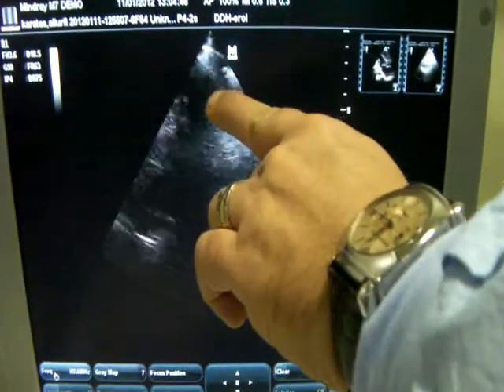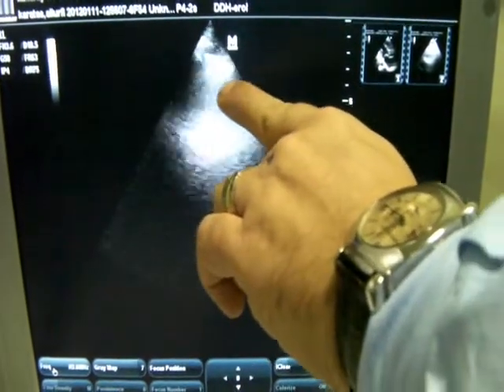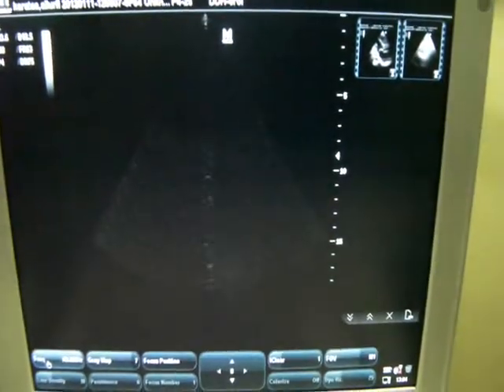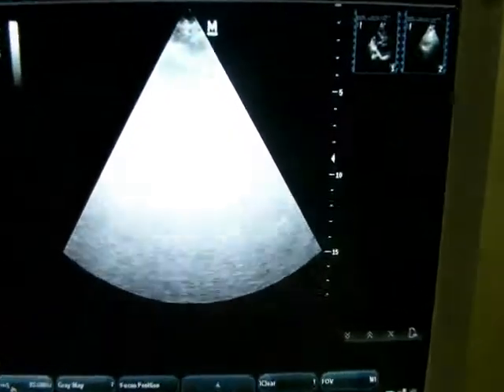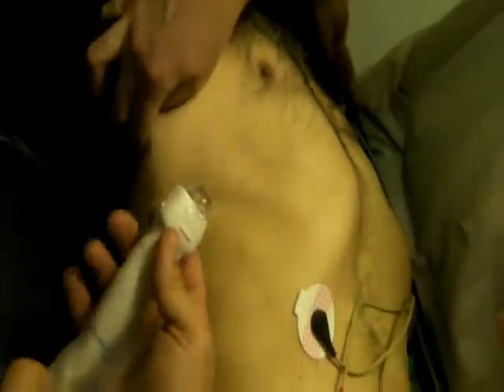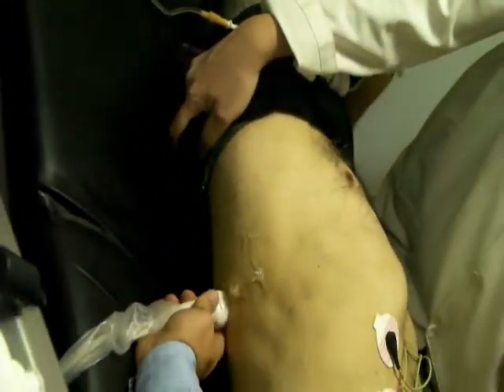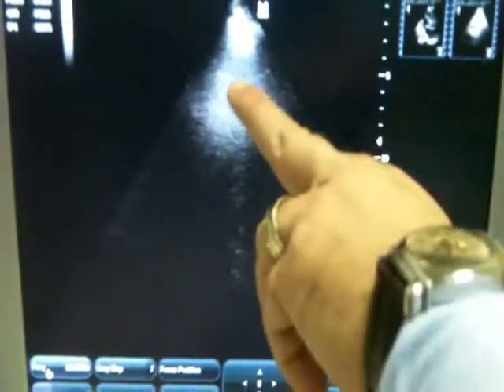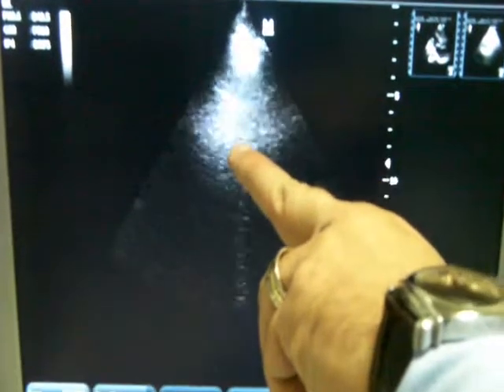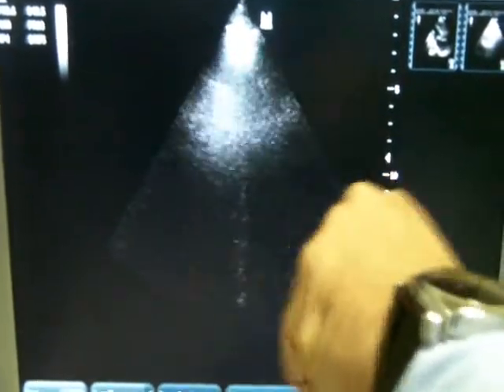On the upper anterior lung zone, the left side of the screen represents the head of the patient and the right side represents the foot. At the top of the screen, we see a hyperechoic line called the pleural line. On both sides of the pleural line, we see the shadows of the costal bones. This is called the BAT sign, and we always try to localize this BAT sign on the screen.